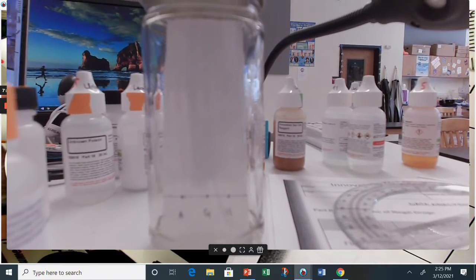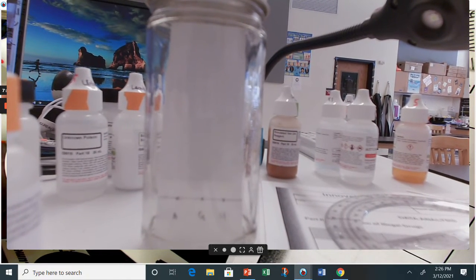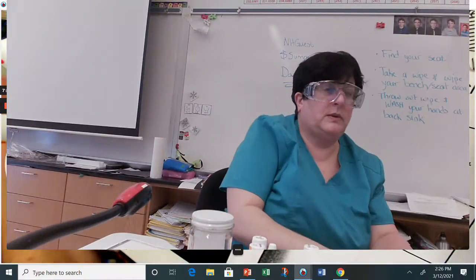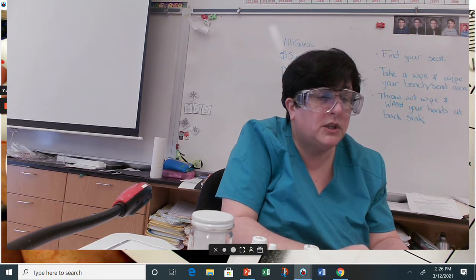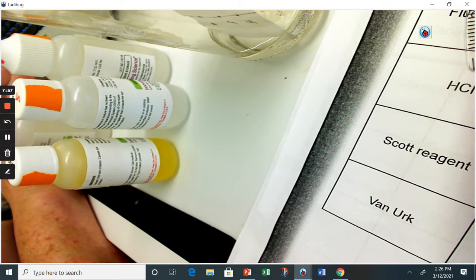All right, so let me pause this. Sorry, it's really hard, guys, when I'm using my left hand that's got a glove on it. Hold on. And it's not registering on my mouse pad. So silly, isn't it? And all I want to do now is get out of this and pause. It's not letting me pause. It's not letting me change it. Want to close out? There.